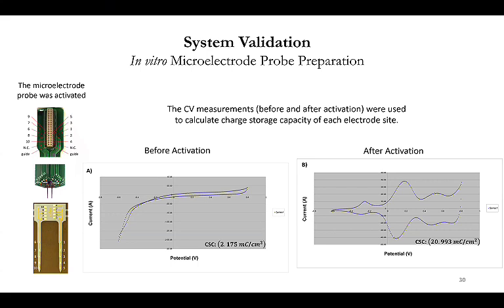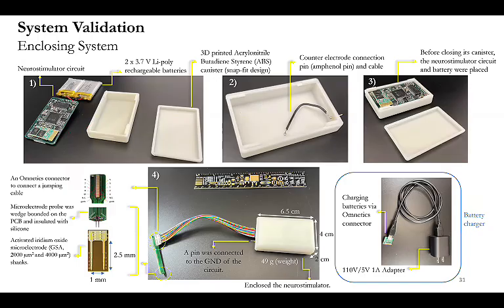So we have a battery and a PCB, and it would be nice to have a canister. So I made a 3D printed ABS material canister, so the cable can easily go out through a certain gap. And I also assigned certain pins for the battery charging.